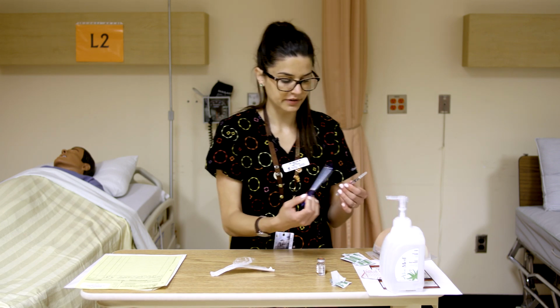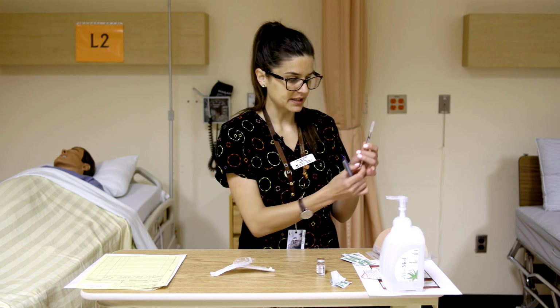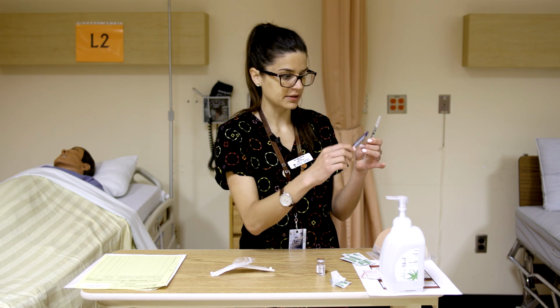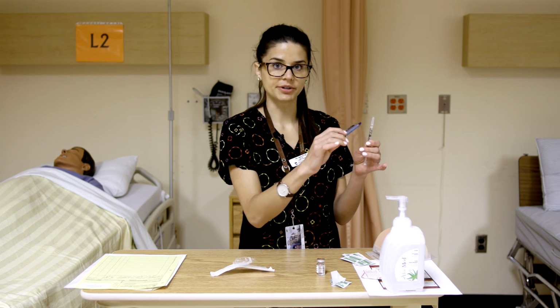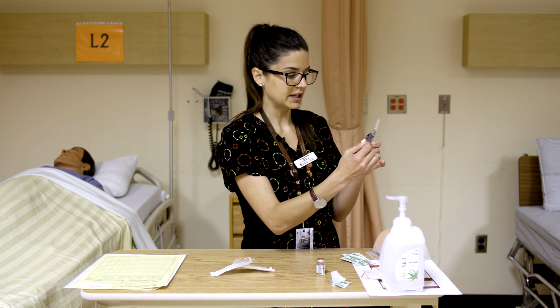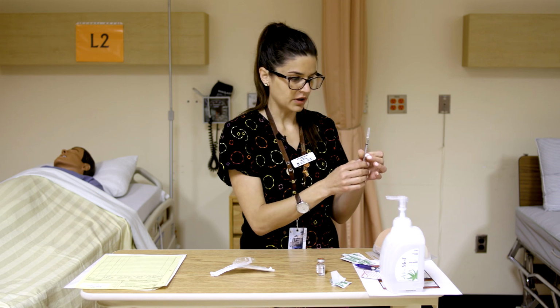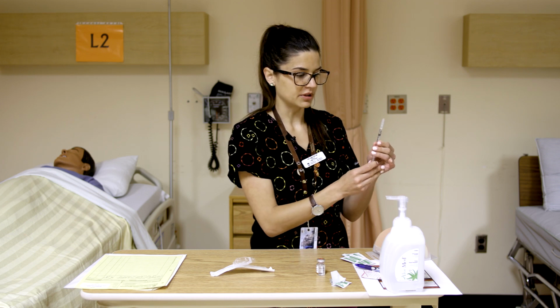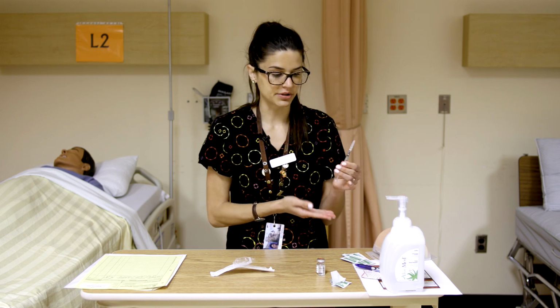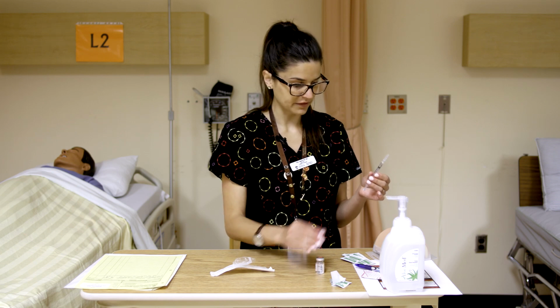Some people like to use their finger or the side of the table to sort of tap out those bubbles. It does help if you pull back a little bit so that the bubbles have somewhere to go, because there's air at the top then. So holding it upright, we're going to whack right at the bubble. Once you've gotten all the bubbles out, you're going to push this up to get to your accurate dose, which again in our case is 0.1 mL. And that's our 5 TU.